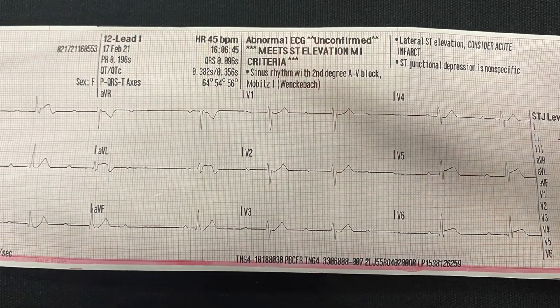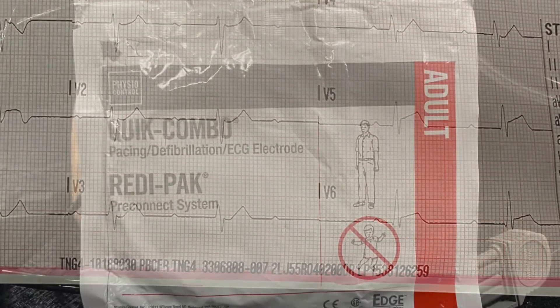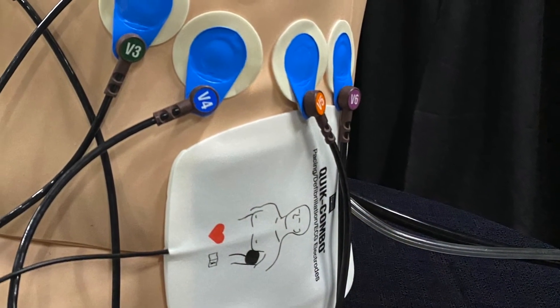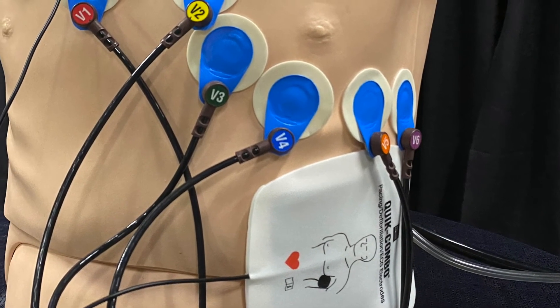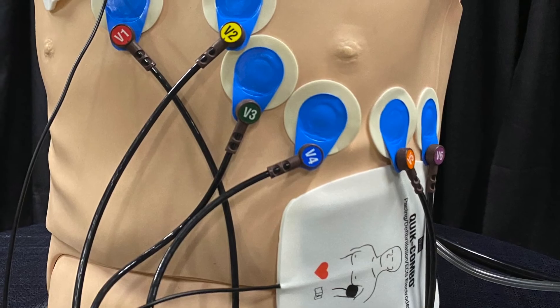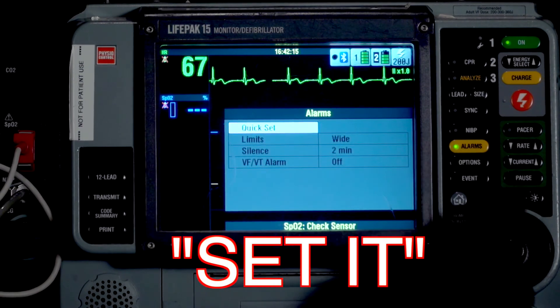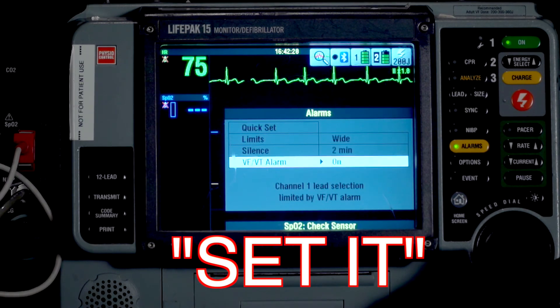Once you notice this patient is a positive STEMI alert and you're sure this patient is having an acute MI, remember to put the pads on the patient. Studies have shown that when you have the pads placed prior to the patient going into VF or VT, it takes less than a minute for the first defibrillation attempt. So put the pads on the patient and remember to turn on the VF/VT alarm on the LifePak.